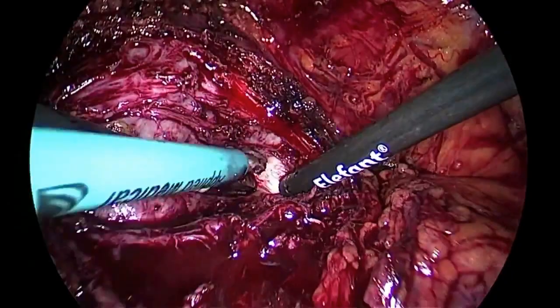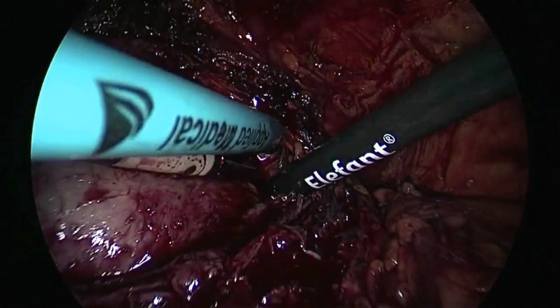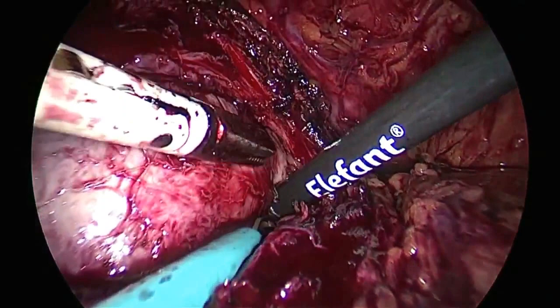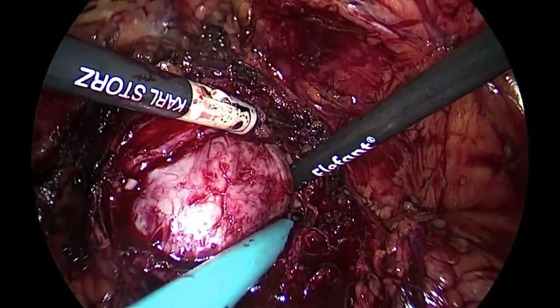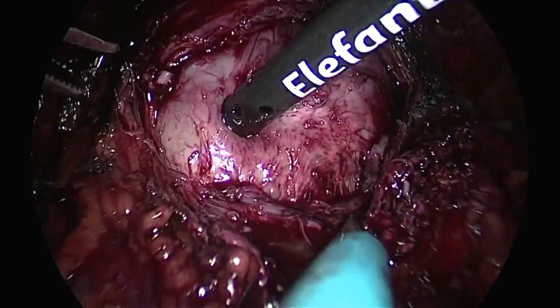Sorry, this step is the most important step, because otherwise, if you don't identify the plane very well, the risk of bleeding during the dissection is very high. So it is very important to identify the plane, and moreover, to perform a coagulation of the vessels, of the capsular vessels, that I am doing in this phase. If you have some questions, I am here for you.